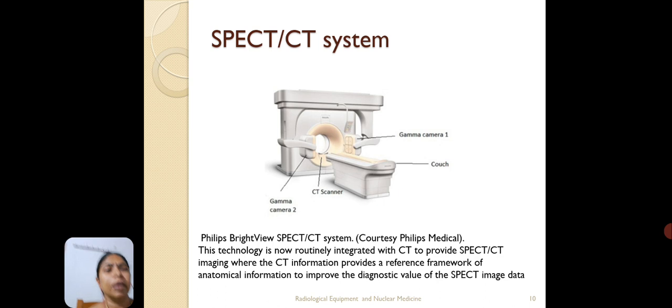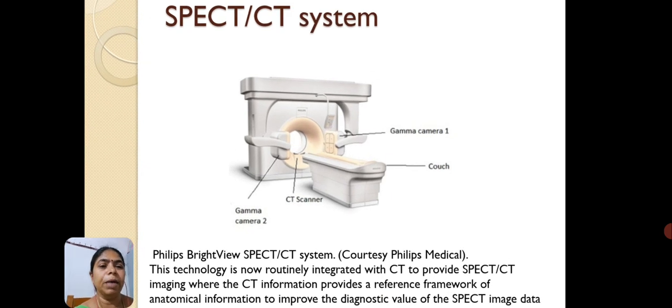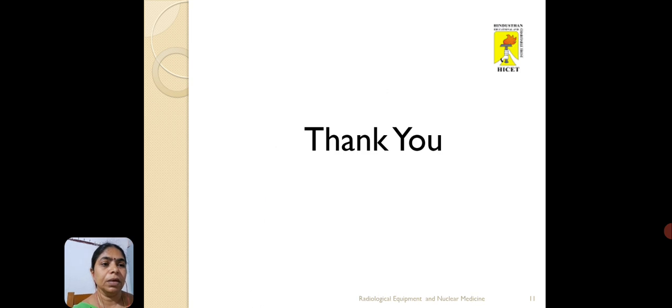Here a photograph of the Philips BrightView SPECT/CT system is shown. This technology is now routinely integrated with computed tomography to provide SPECT/CT imaging, where the CT provides a reference framework, that is anatomical information, to improve the diagnostic value of the SPECT image data. Thank you.